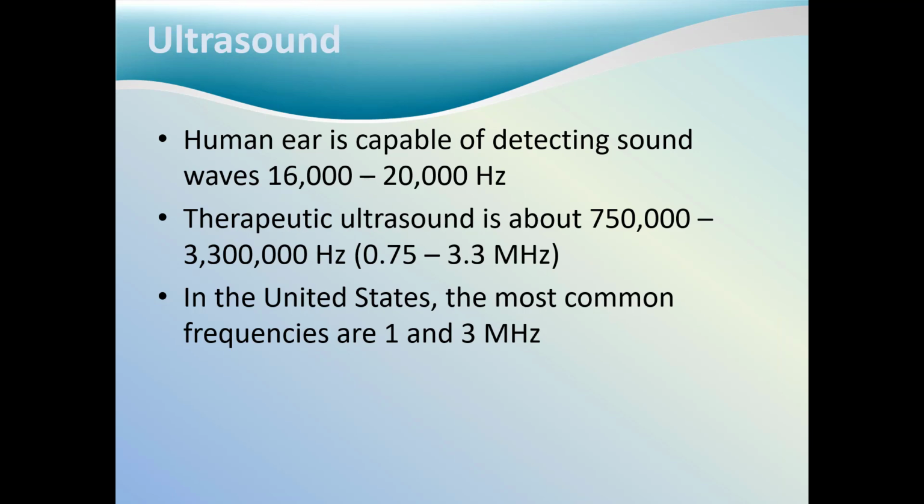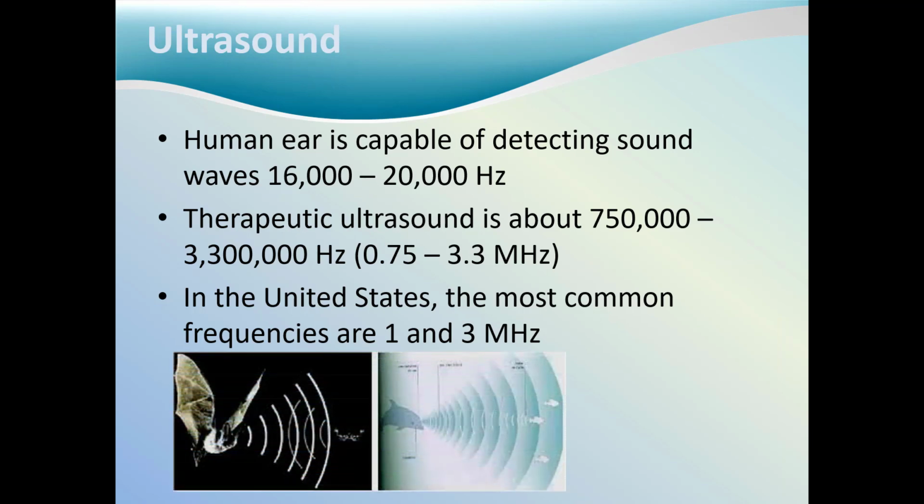Ultrasound and ultrasonic waves. Animals such as bats, dolphins, and whales communicate with each other via sonar-like properties. Many of these transmissions are not heard by the human ear unless they are captured in a medium such as water. The animals make these sounds and listen for the sound to bounce off of objects to determine location and direction.